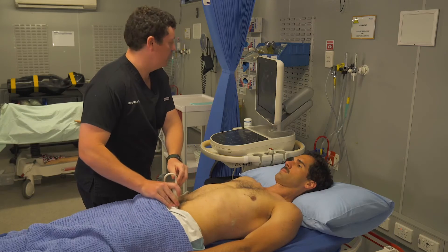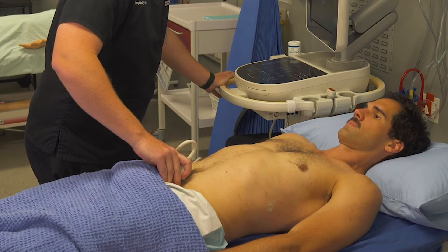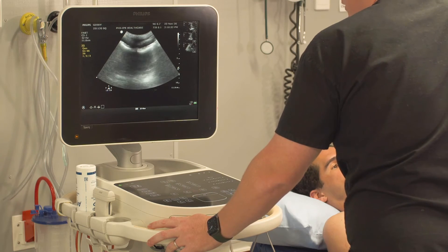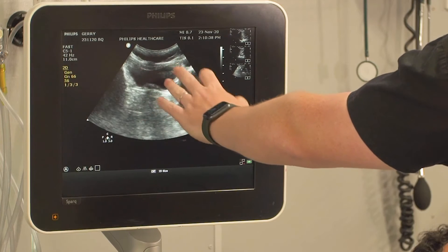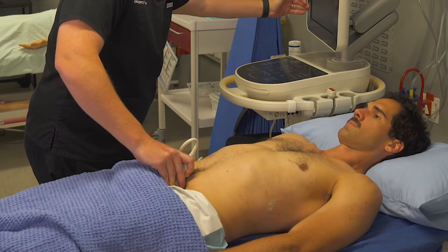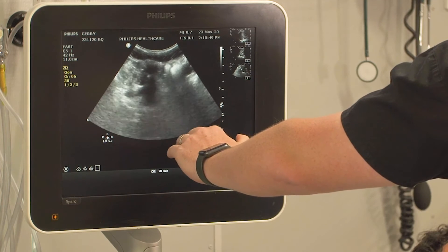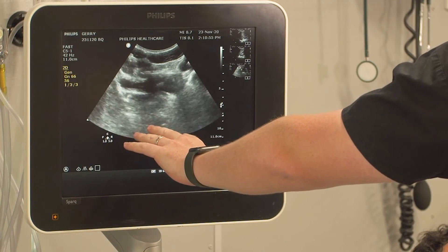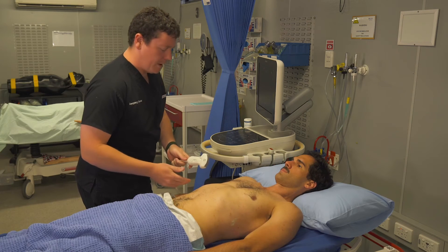Now switching to a transverse pelvis view. Because Jerry's bladder is fairly empty, we need to press down and look up. Start by visualizing the pubic symphysis, then drop off to see the bladder with the prostate, and then come forward to visualize the seminal vesicles — though here we have some bowel gas interference. We're looking laterally on each side for fluid. This is clearly a negative scan.